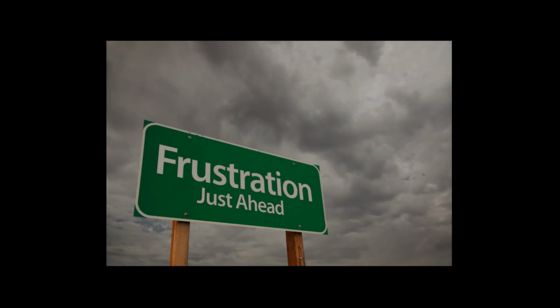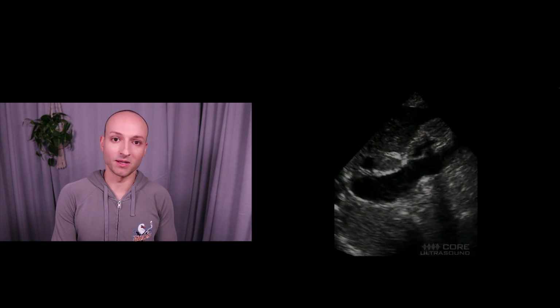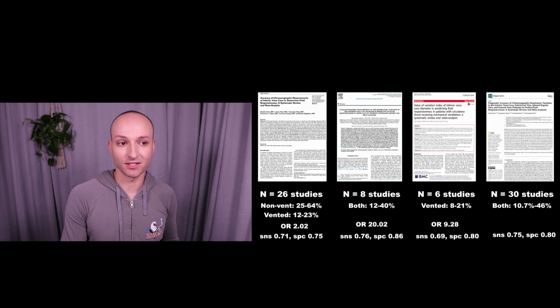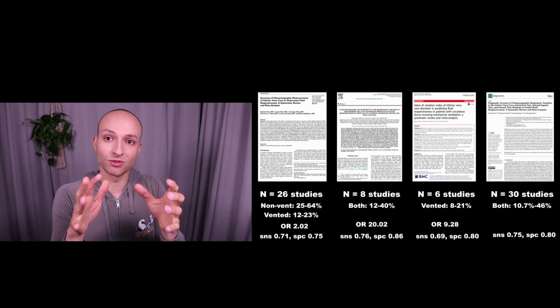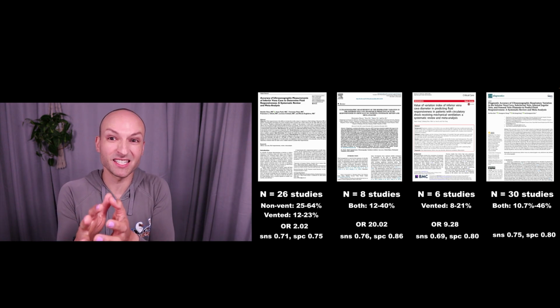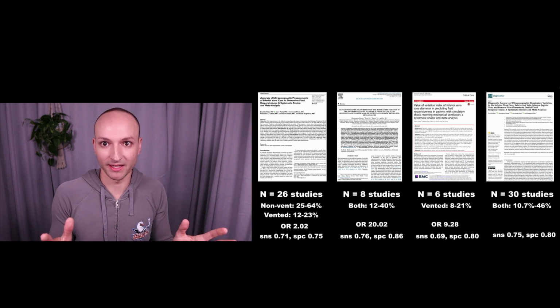But if you want to get an exact number, the number is all over the place. That's one of the problems with IVC: the data is good, but oftentimes you can't use one study and add it to another study because they use different cutoffs and sometimes even different calculations to measure it, which is really frustrating actually.